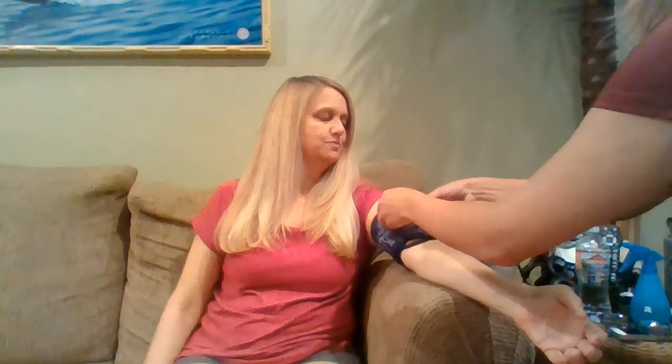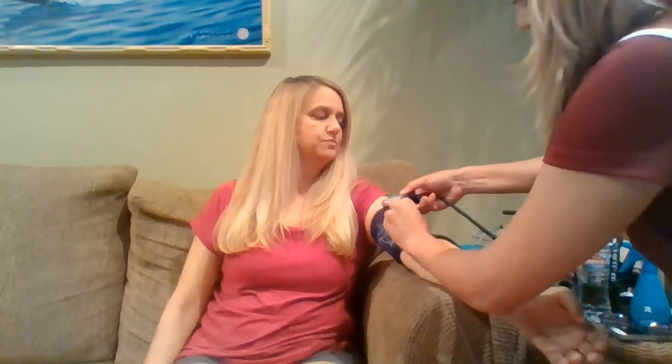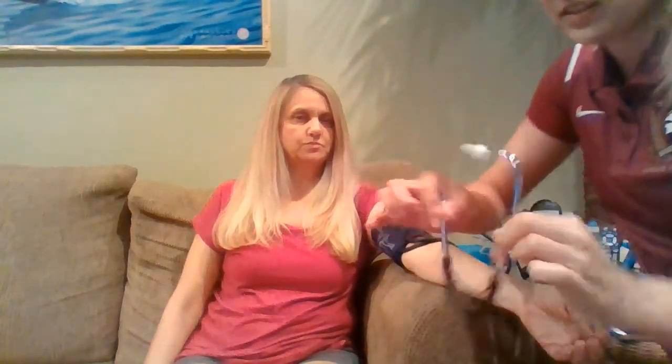That's secure. All right. And then we've got this sphygmomanometer, and we're just going to attach that to the cuff so that I can see it as I'm taking her blood pressure. I'll reattach that. All right. Got my stethoscope.